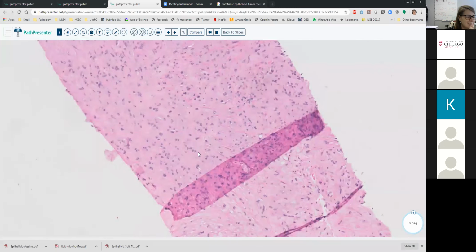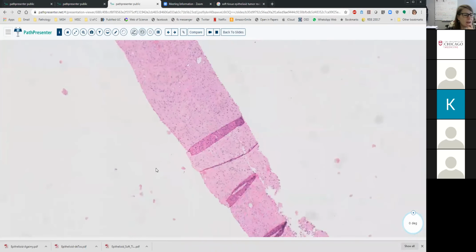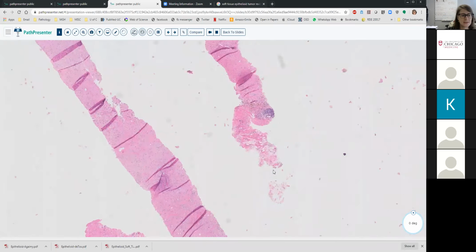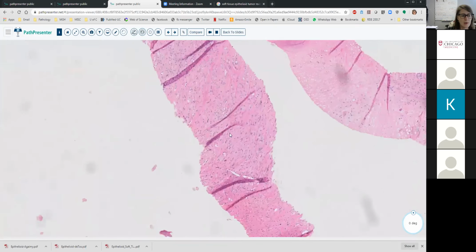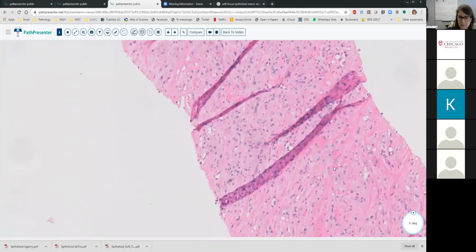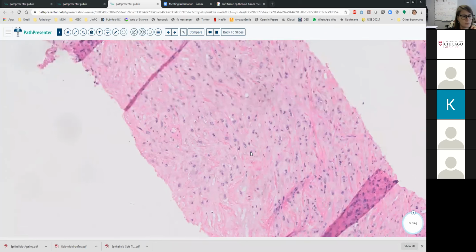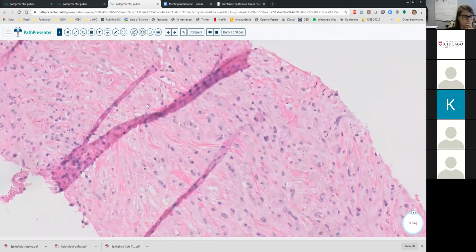So, all right, pause there. Excellent. In fact, this was a woman with an axillary mass and potentially lymph node involvement. And so you say, I want to rule out lobular breast cancer because it's kind of single file, with some signet ring cells. What stains do you think are going to help you? I think at least to determine origin of the cells, maybe a GATA3 would help.